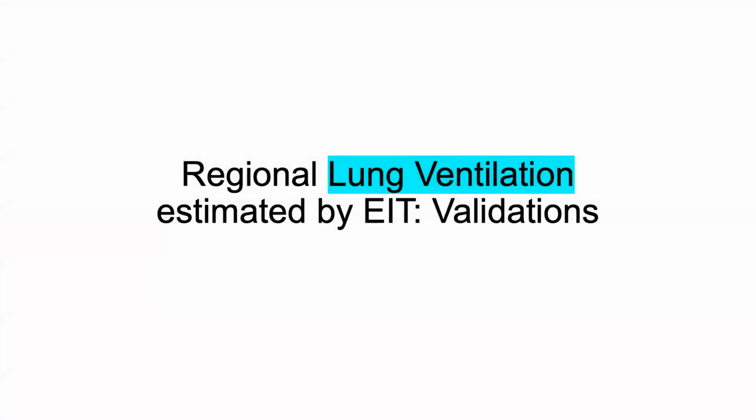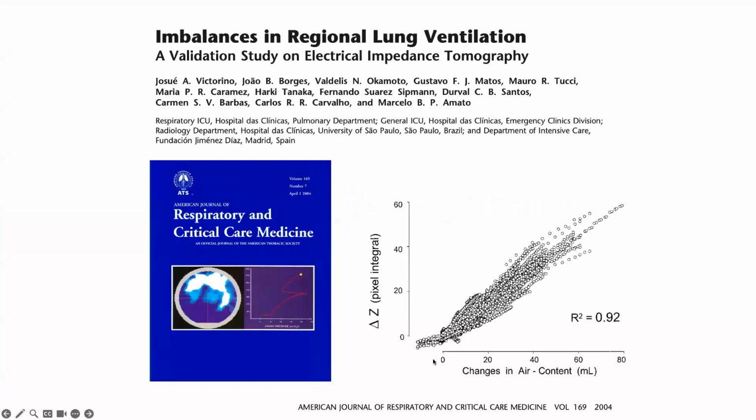So what about the validations of those measurements of lung ventilation? This was one of the first papers published in the Blue Journal by Dr. Victorino and Dr. Marcelo Amato in 2004. In this study, the authors compared the change in electrical impedance with computerized tomography, dynamic CT, in a population of critically ill patients under mechanical ventilation.